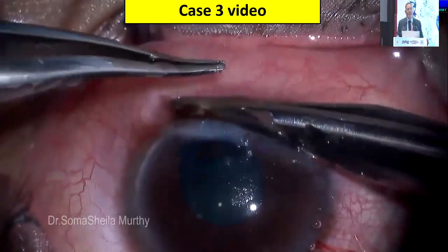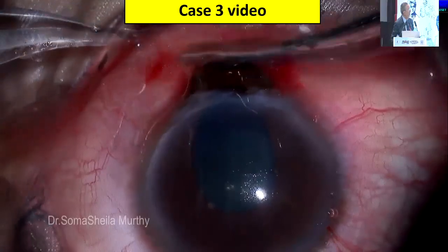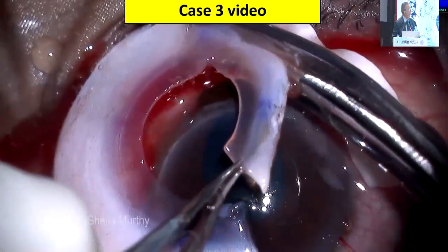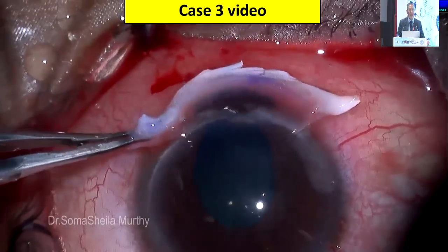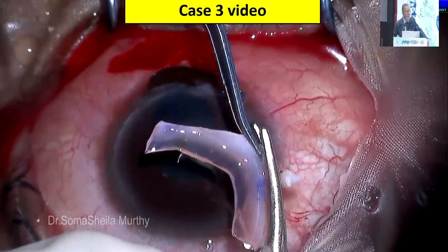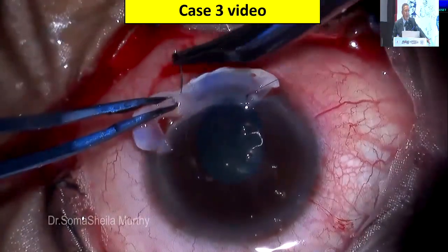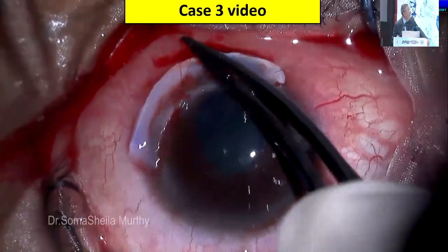It's not a road traffic accident. If that was so, you would not tuck in an iris, but here you can try and tuck it in. You do a small iridectomy there and try and preserve as much of the iris as you can. Again, the same principle. Here you're making use of remnants of a PK which has been used, so the remaining part of the cornea can be used. So if you are in a high volume center where you have such things, you don't have to sacrifice normal cornea. You can take the remnants from a PK patient.